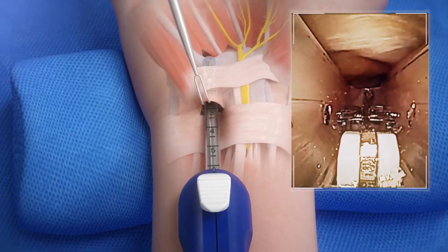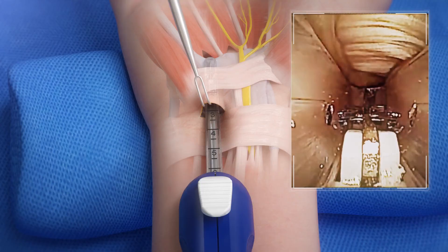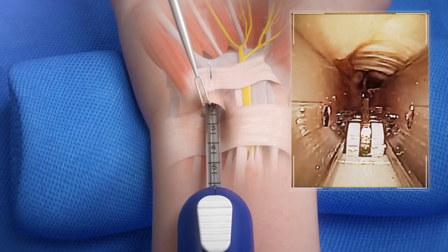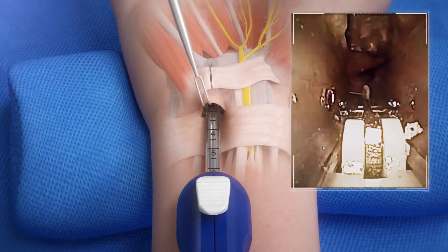Once the end of the ligament is visualized and a clear path is established, deploy the blade and pull back to transect the ligament. Reinsert the device to confirm complete division of the transverse carpal ligament.